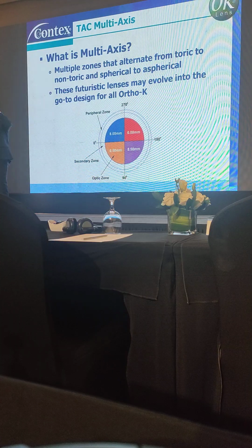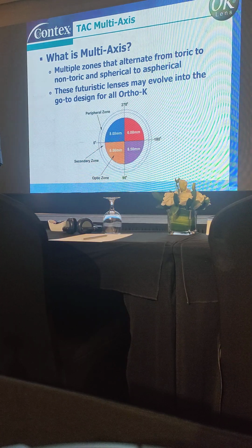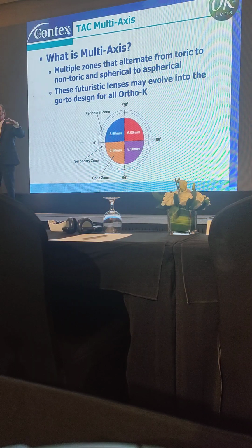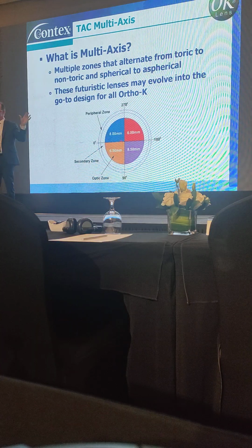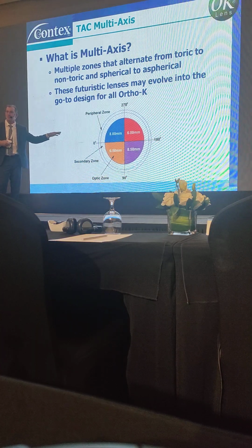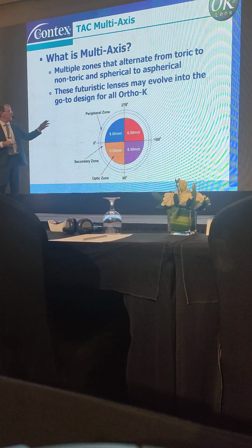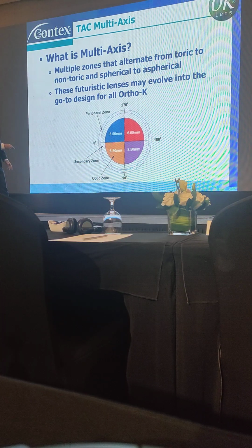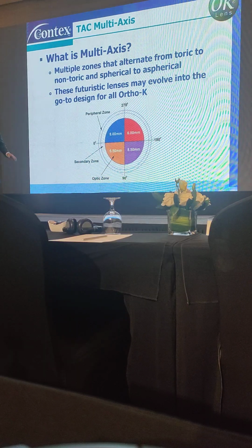And, you know, there is a company, and I'll give them a little credit, is Wave lenses. It's a good system. They can make freeform lenses like what we do. We can make freeform lenses where we're changing the curve every 5 degrees. We have a different curve on some of these corneas.